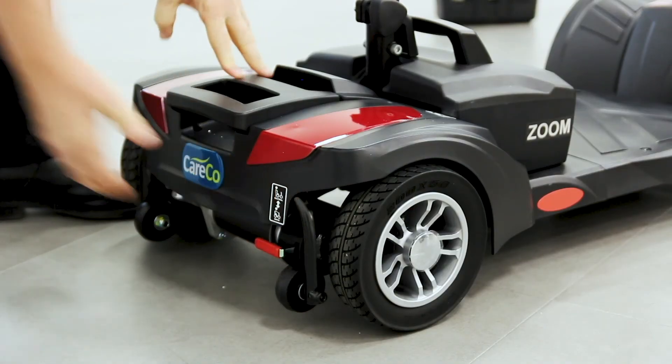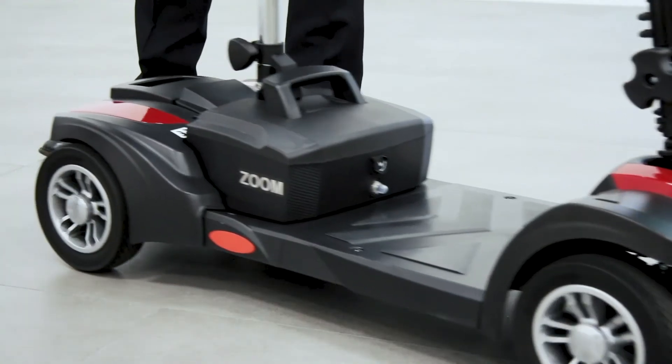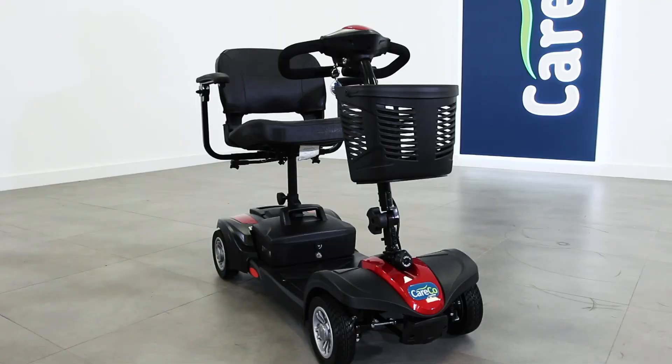To push the scooter manually, flip the red lever on the back to put it in free wheel mode. When you wish to resume driving, remember to flick the lever back into drive mode, otherwise the engine will remain disconnected.